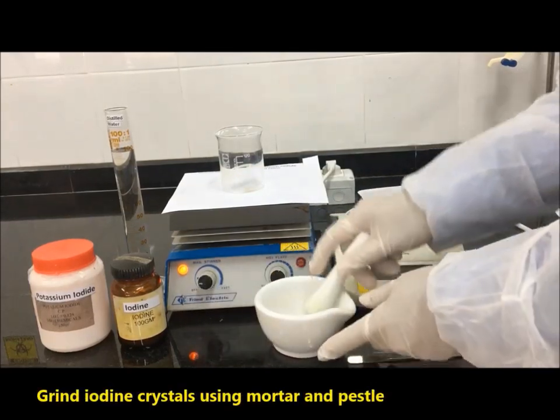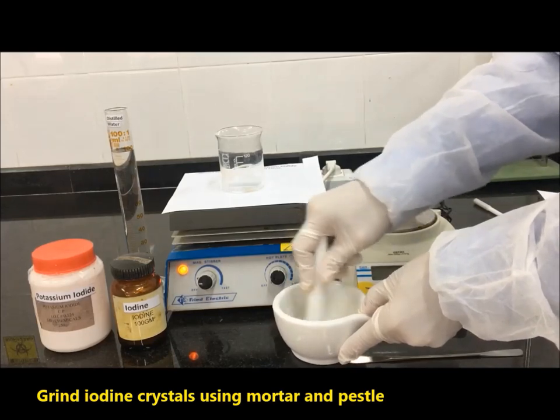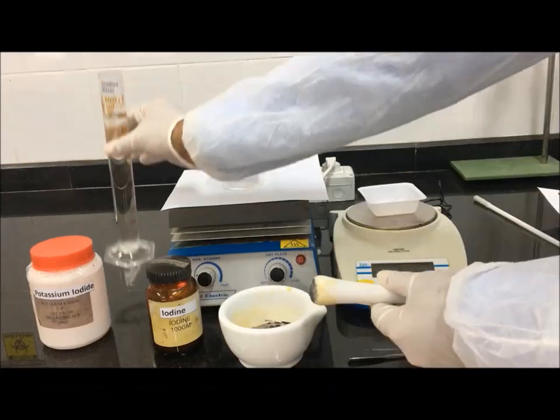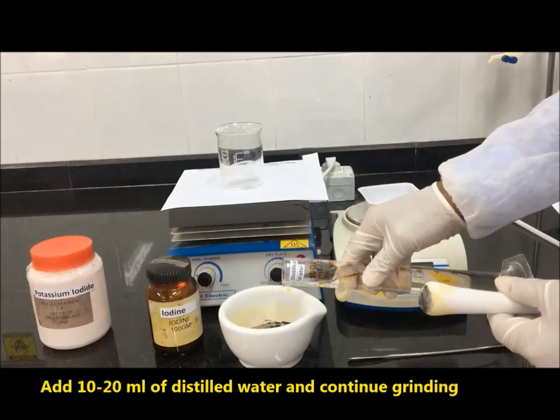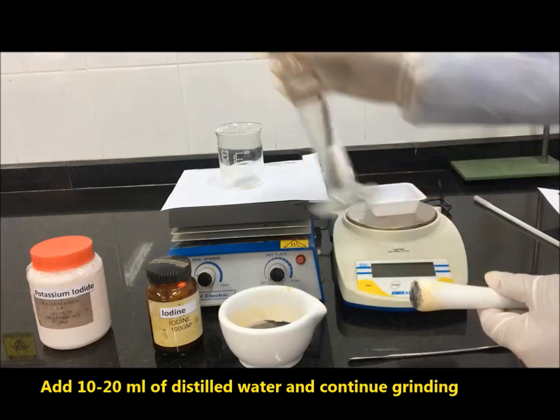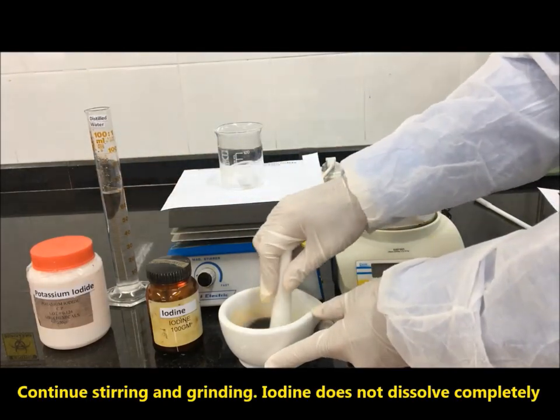Grind iodine crystals using mortar and pestle. Add 10 to 20 ml of distilled water and continue grinding and stirring. Note that iodine does not dissolve completely.